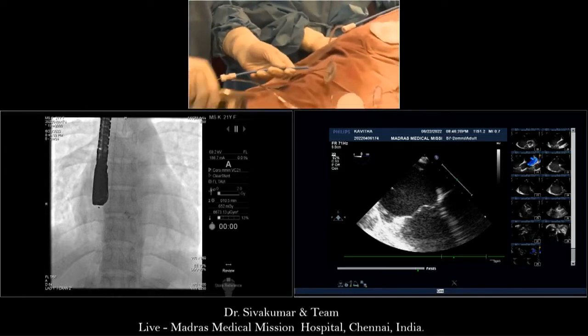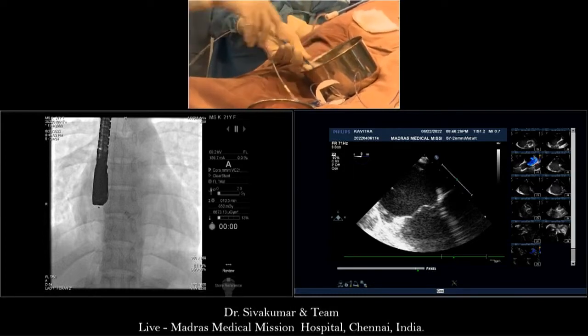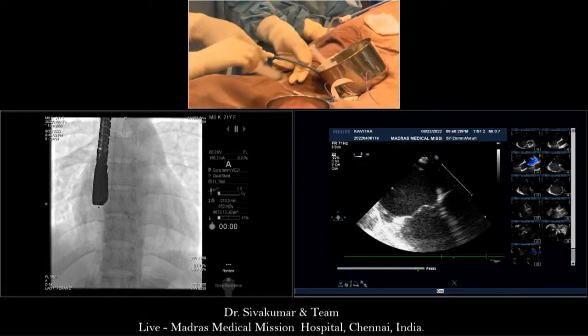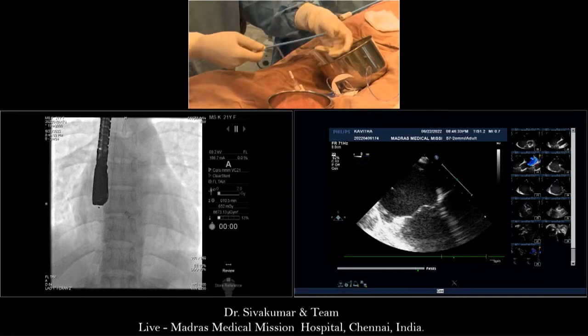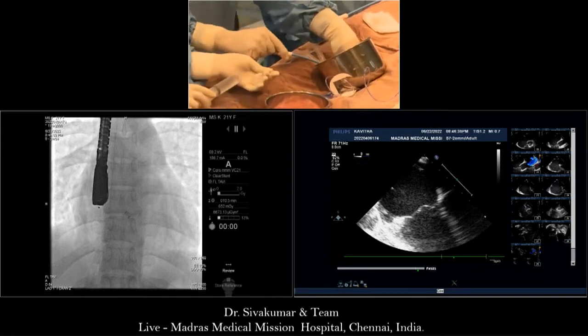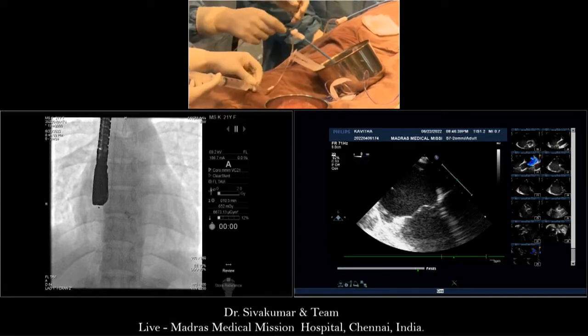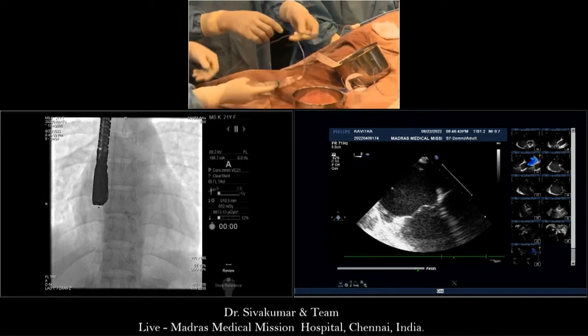No, Siva, that's why I said several times, it's your patient, it's your decision, you should do what you want to do. And we really appreciate in the room that you chose to take it out and put a smaller device in, which we all agree, apart from Zaid, is too small. So let's ask the room. So that 36, was it fine? Yes, one says fine. Any other fines apart from these two?